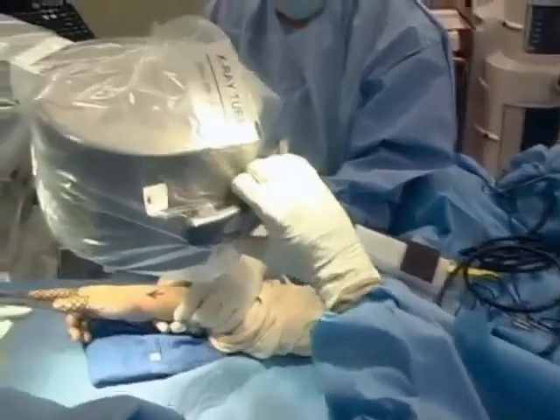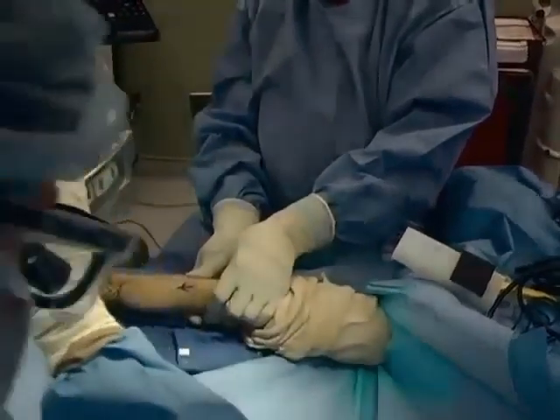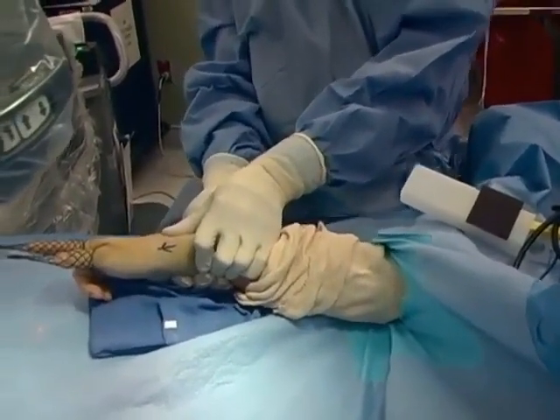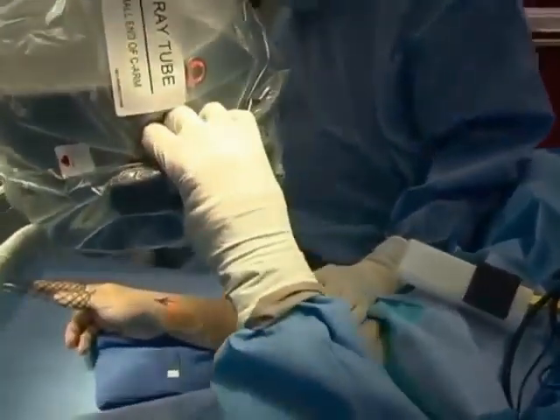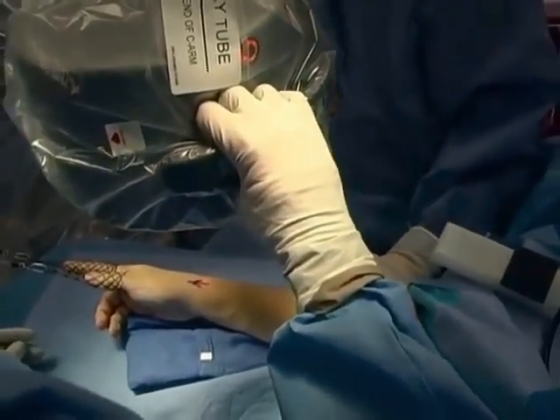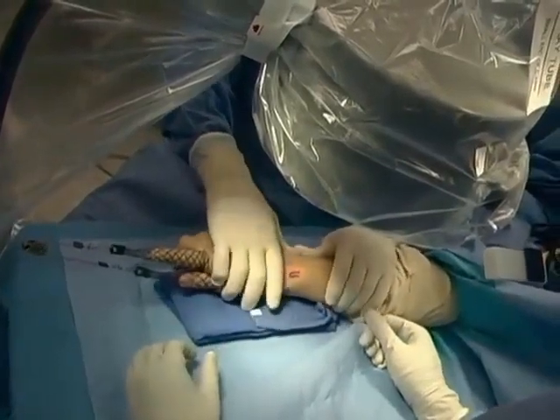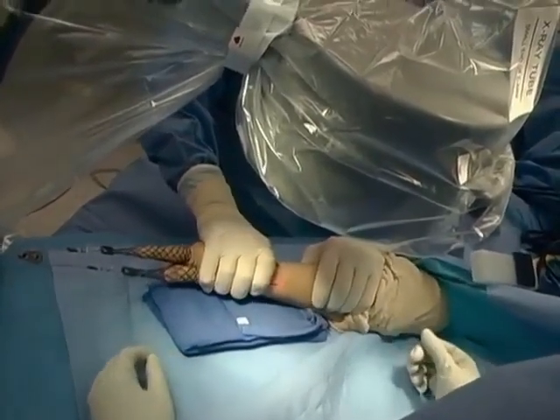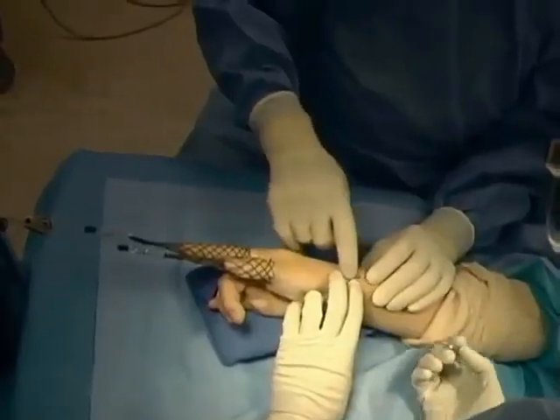The tourniquet is inflated and the image intensifier is brought into the operative field to assist in the reduction of the fracture. Direct pressure is applied to the dorsum of the distal radial metaphysis to try to correct the dorsal tilt, and radiographs are obtained to confirm that reduction. In this instance, the fracture was radially translated and an attempt was made to correct that radial translation by ulnar deviation of the wrist.